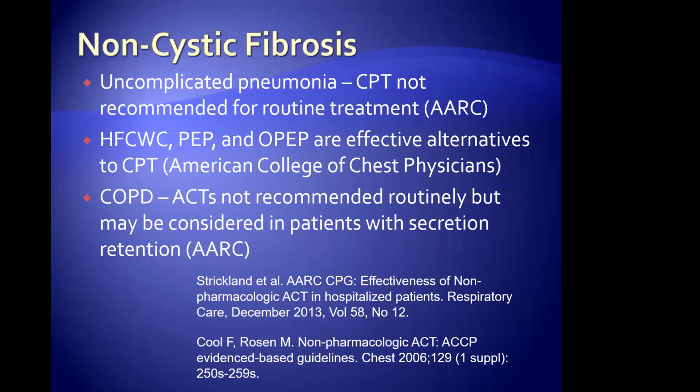So now here's some other opportunities that we have to do this. High frequency chest wall compression, the vest, PEP therapy, OPEP, effective alternatives to CPT. And I didn't come up with this. You didn't come up with this. The American College of Chest Physicians, hello, they came up with this. CPT is not recommended for COPD patients.